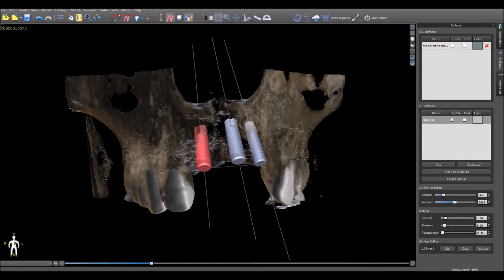The BlueSkyPlan software now allows very fine, minute control, almost on the pixel-by-pixel level in the moving and rotation of implants, virtual teeth, and the models.